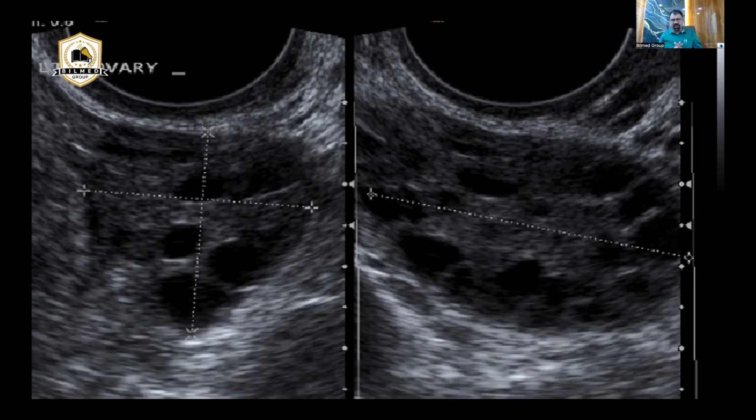Now, what is the pulse repetition frequency? Pulse repetition frequency is the repetition of the pulses sent by the machine. If the machine has sent one now, how long it will take for the next pulse to be sent, that is the pulse repetition frequency. Now, the practical implementation of this is that if I put a question to you, you will give me answers in the comment box, a chat box is there.